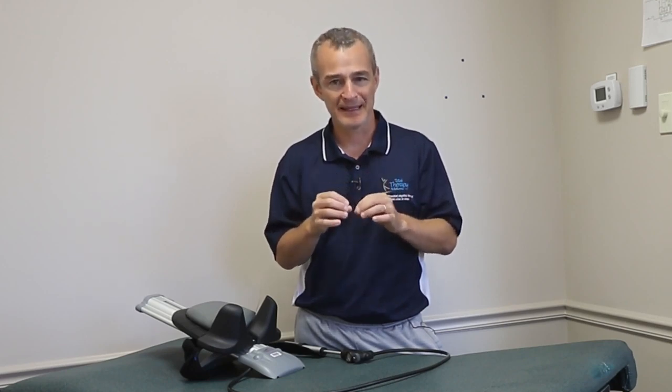What I'm going to do is I'm going to try to produce a little bit of distraction, a little bit of pressure. I usually target about 8 to 12 pounds at the max. And the hope is that the body will relax. That relaxation will turn down the tension in those muscles, allowing the neck and the vertebral bodies to naturally open up a little bit, naturally gap a little bit. So if there are bone spurs, if there is stenosis, if there is a narrowing of the canals where the nerves are going through, maybe we get just a little bit of space in there. Maybe we create a little bit of suction, which allows the synovial fluid, the nutrients to come into the joint. And then when you come off the device, kind of everything squishes back out, but we facilitate that fluid exchange. And the body just relaxes.